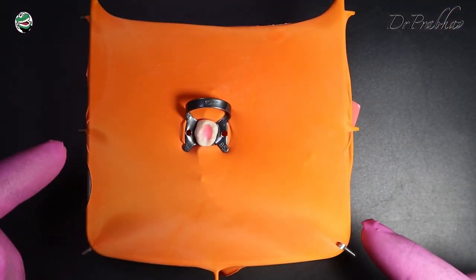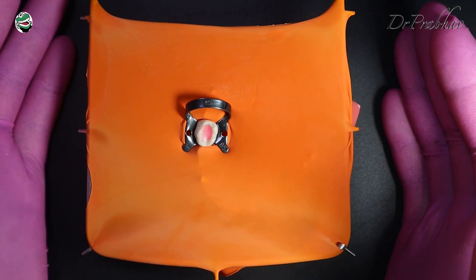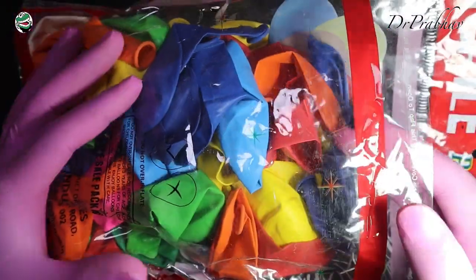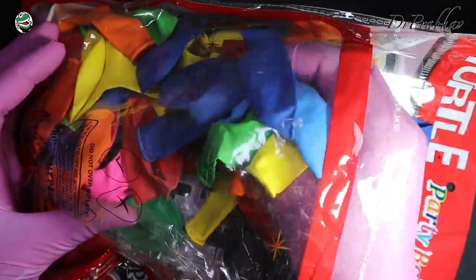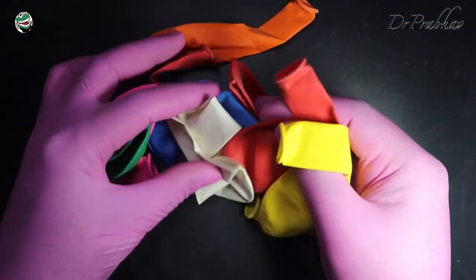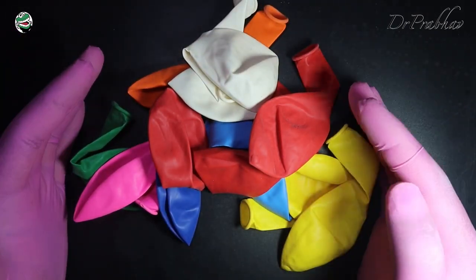Hi friends, today we are going to learn about the colorful rubber dam placement in pediatric dentistry with the help of balloons. So let's begin. So the first thing is we are going to take lots of multicolored balloons of medium size, and these balloons will be used as rubber dam sheets. The best thing is that you can choose these different colors as an option for your pediatric patients.